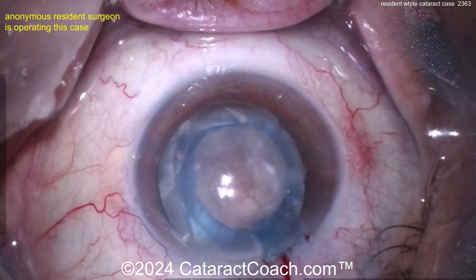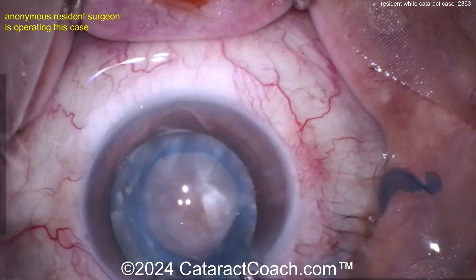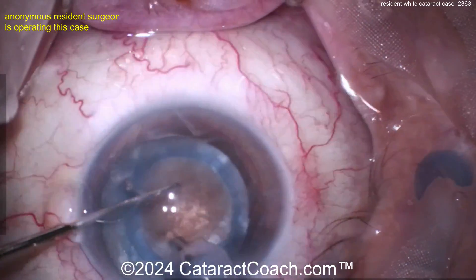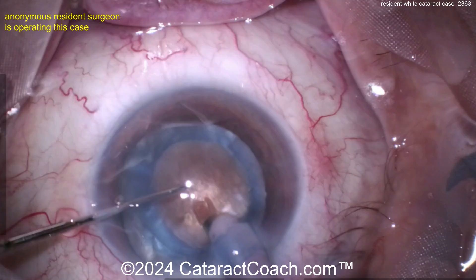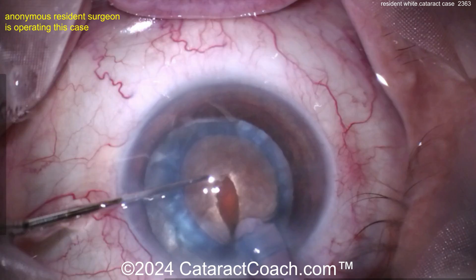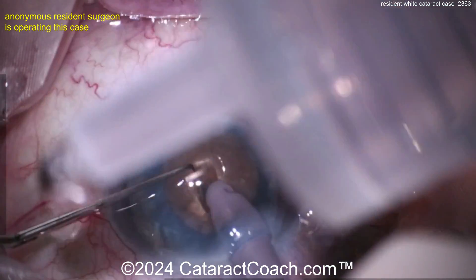Now with the phaco probe going inside, you can see a little bit of brownness — this is not a real soft lens, there's density. That brownness tells me density. Here's a groove down the middle — look at that density. You can tell for sure this is a relatively dense nucleus. Groove, groove, groove — and let's see, maybe splitting it here.